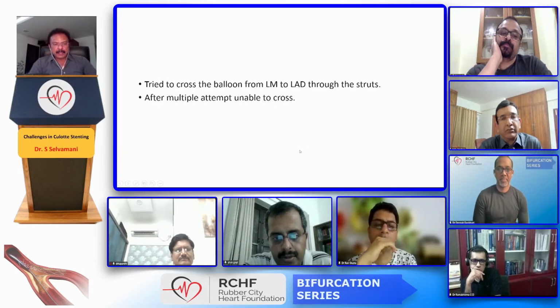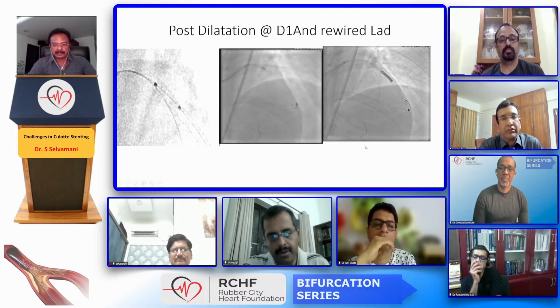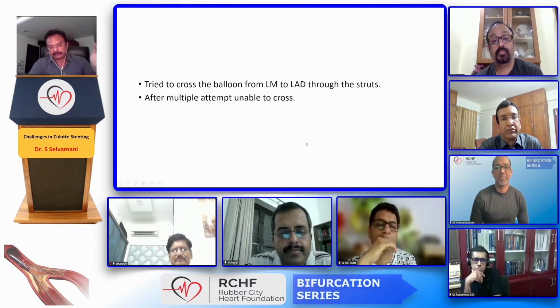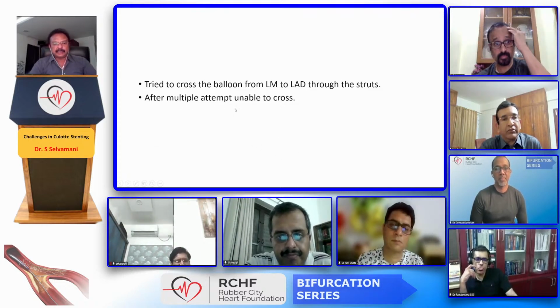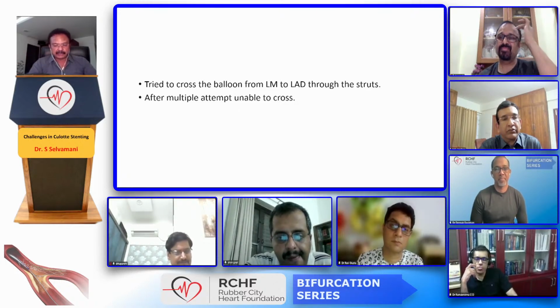And what happened is, I rewired the LAD. After dilating, I rewired the LAD. Then I tried to cross the balloon from the proximal LAD to the distal LAD. Sorry, they have mentioned it as left main. From the LAD, we could not cross at all. Multiple attempts, trying to take the balloon, repositioning, doing everything.